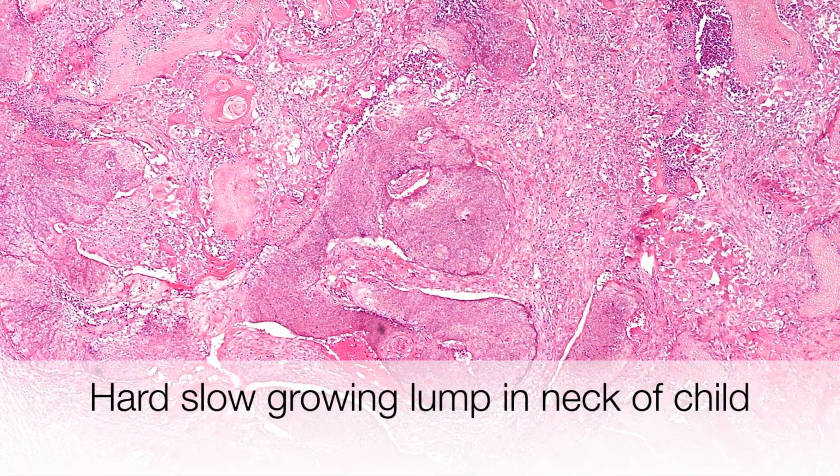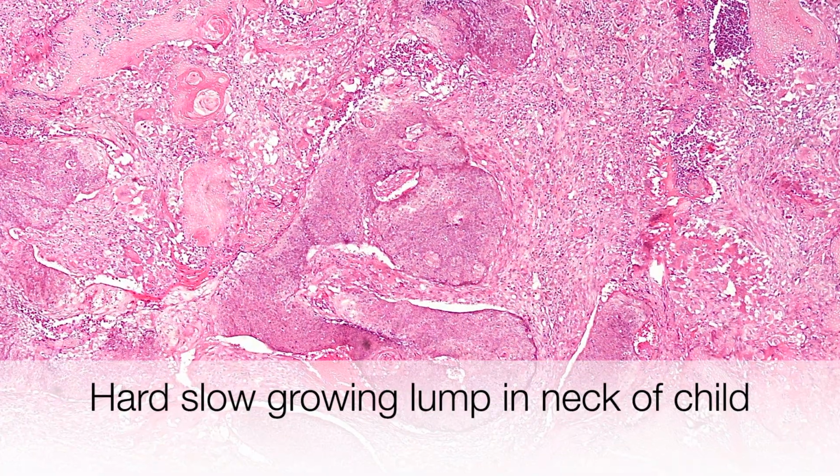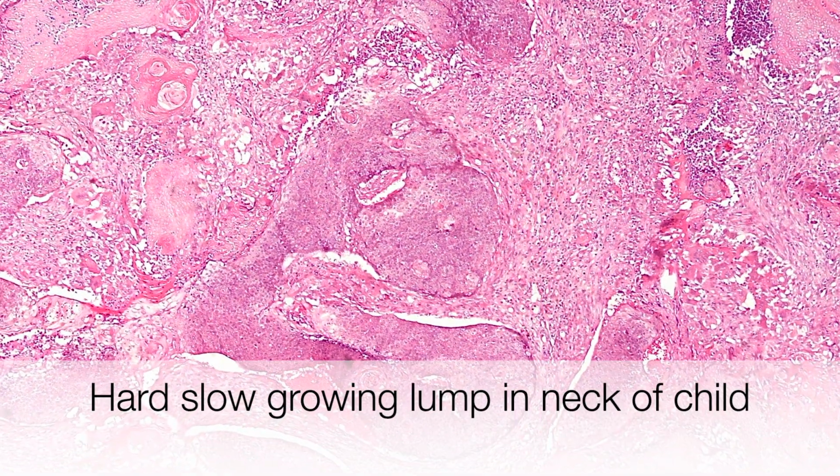Last question. This is a hard and slow growing lump in the neck of a child in the skin. What is it?